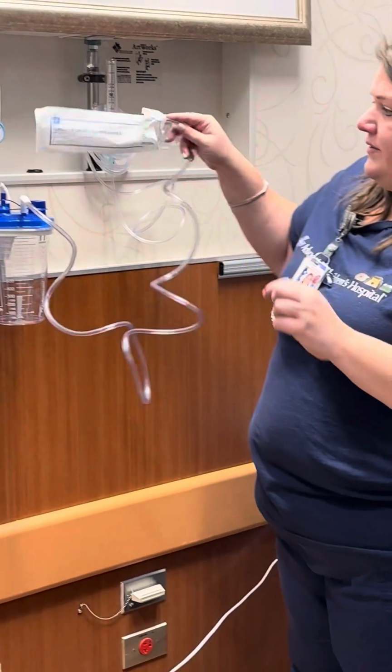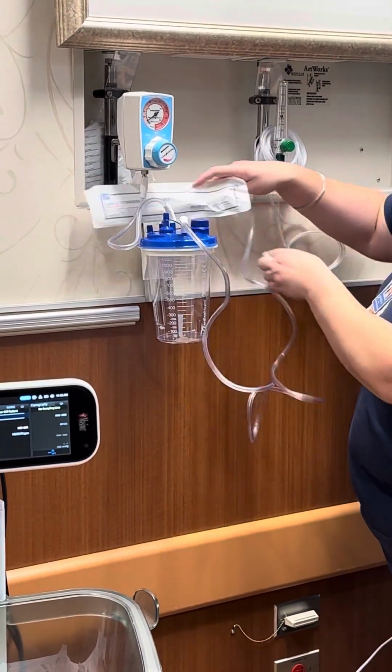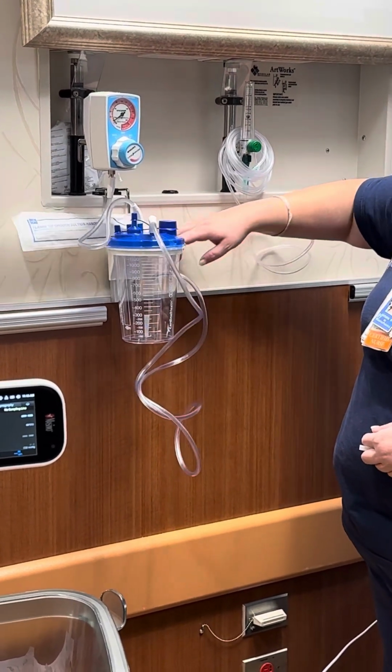So you could leave this whole entire thing all set up for your MAG patient anytime you're gonna have one, or any other high-risk patient that you feel could use the emergency equipment.